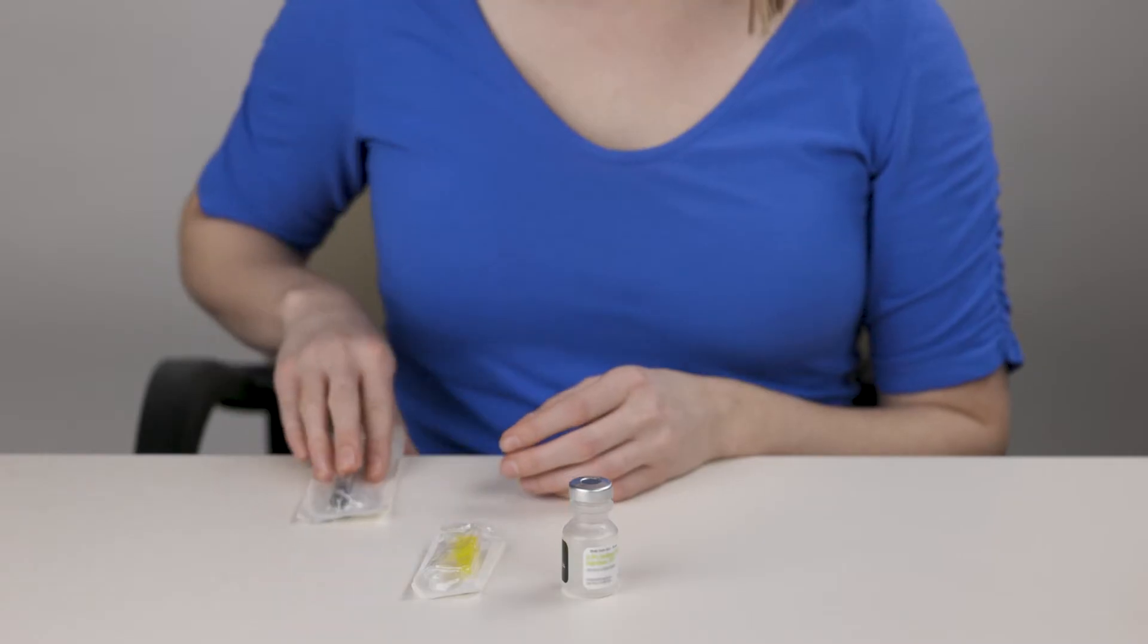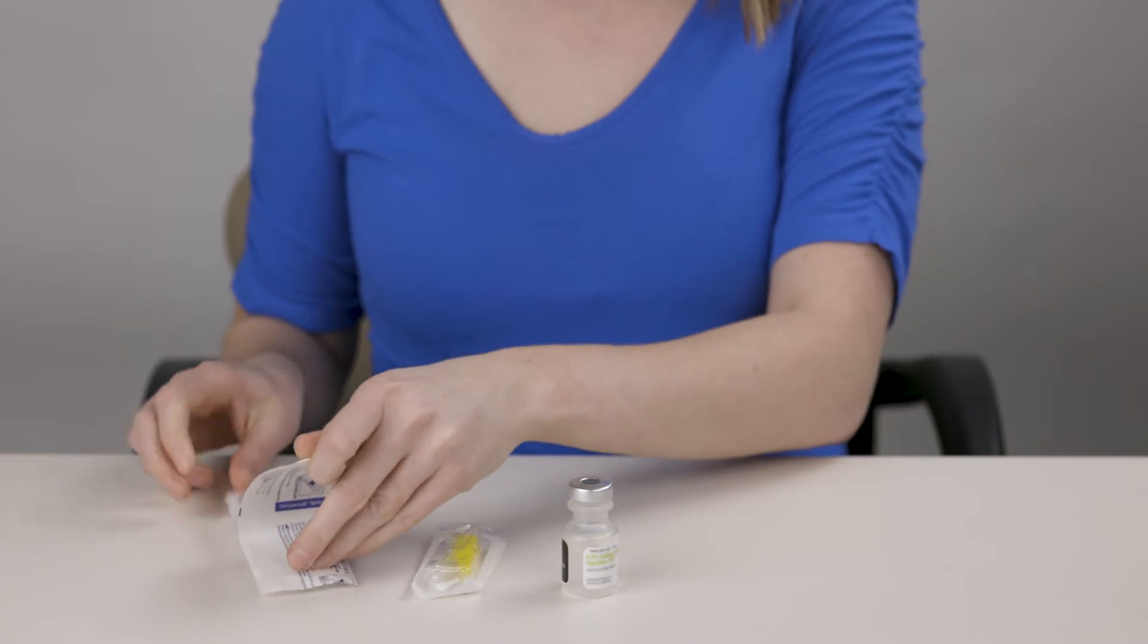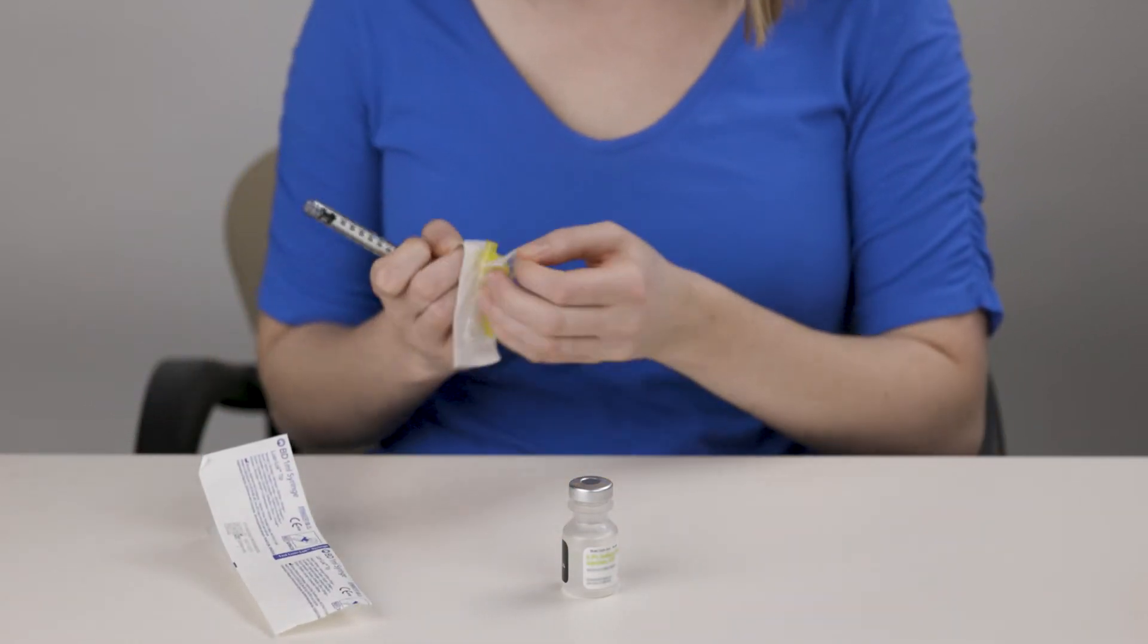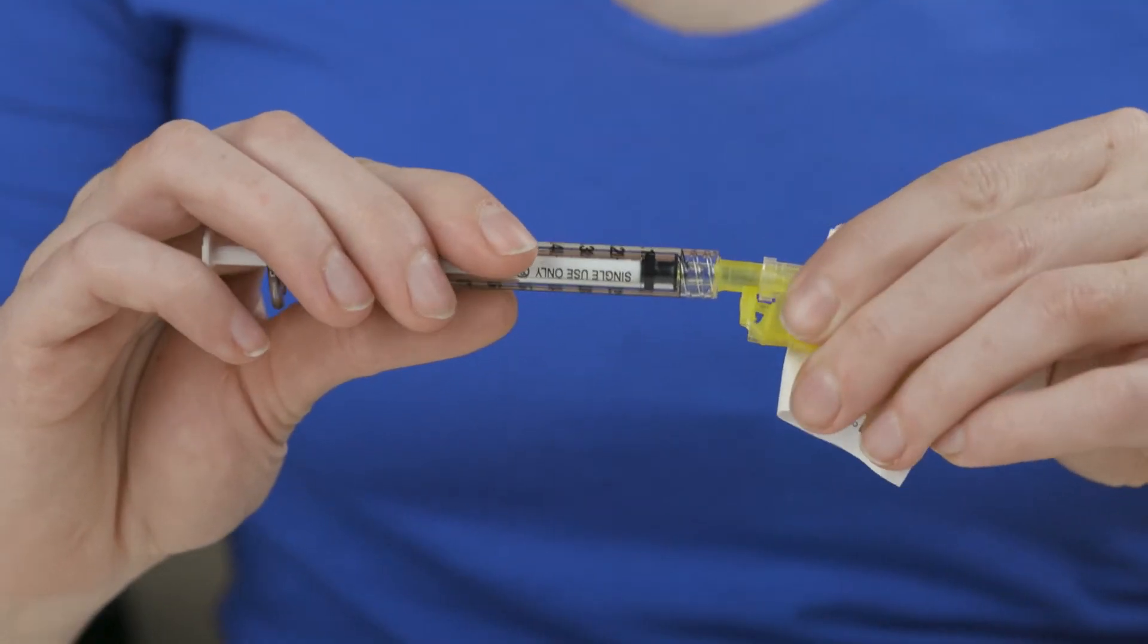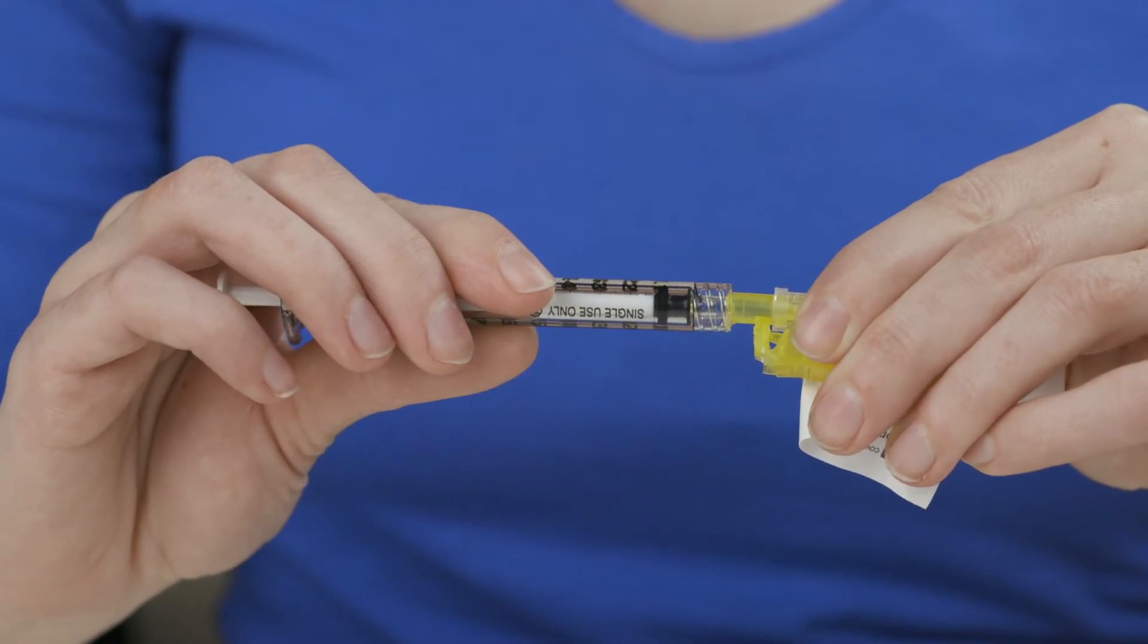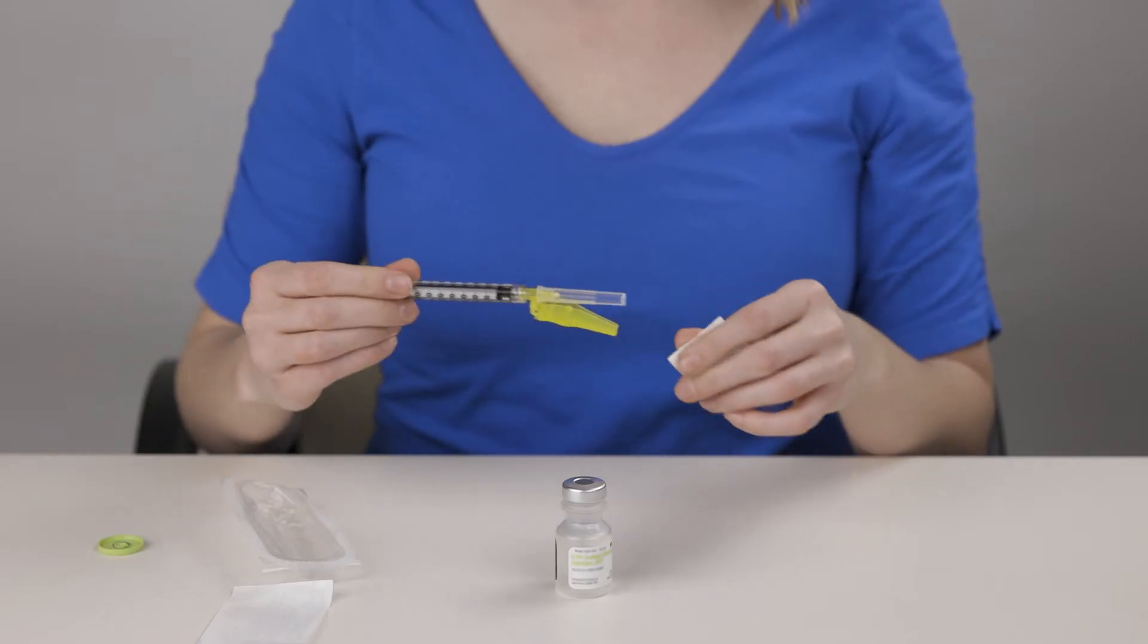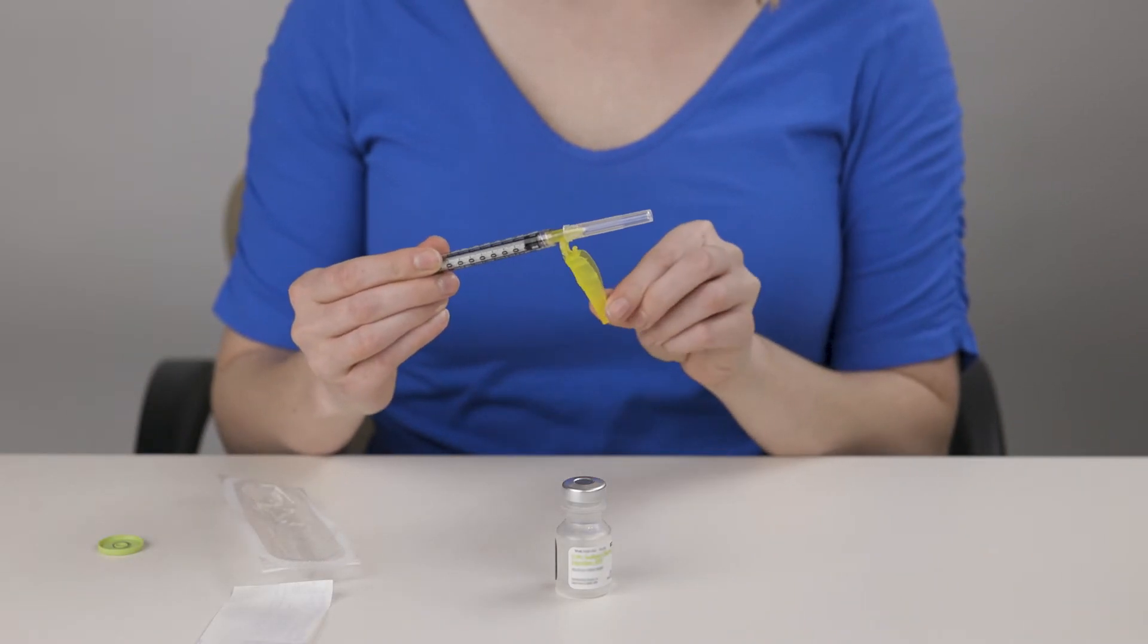Unwrap the needle and syringe. To join them together, insert the tip of the syringe into the bottom of the needle by pushing in and turning clockwise. Move the safety feature away from the needle.